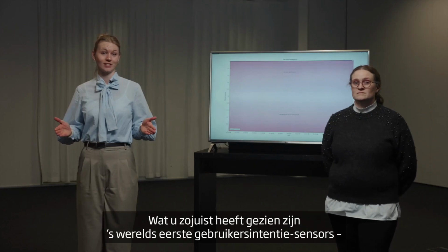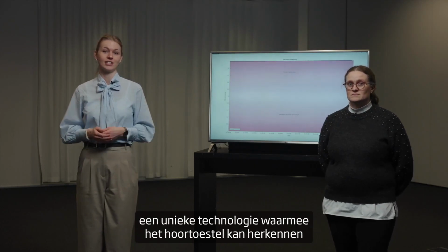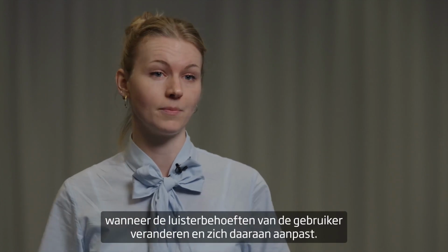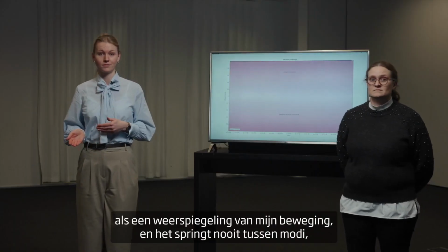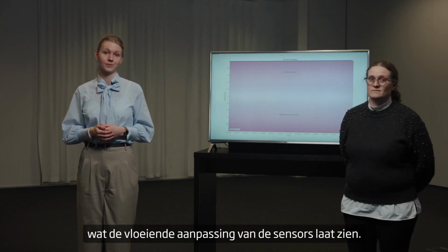What you have just witnessed is the world's first user intent sensors, a unique technology that allows the hearing aid to recognize when the user's listening needs change and then adapt accordingly. As evident on the screen, the curve moved up and down as a reflection of my movement, and it never jumped between modes, which really shows the seamless adaptation of the sensors.